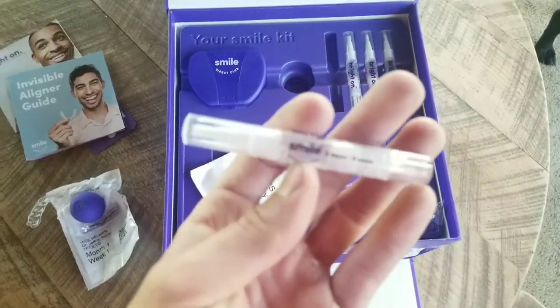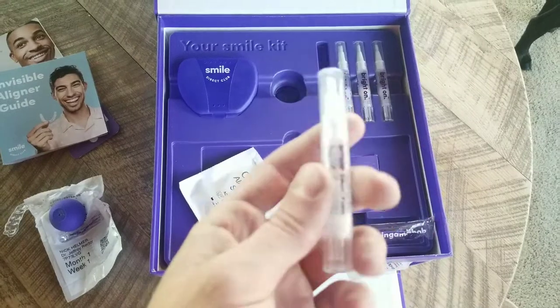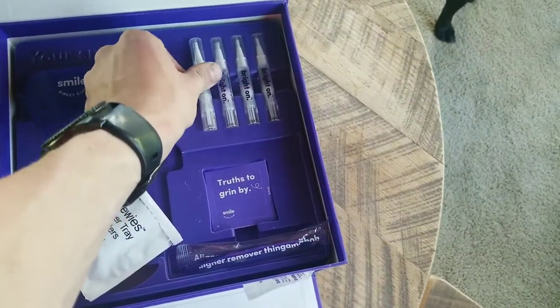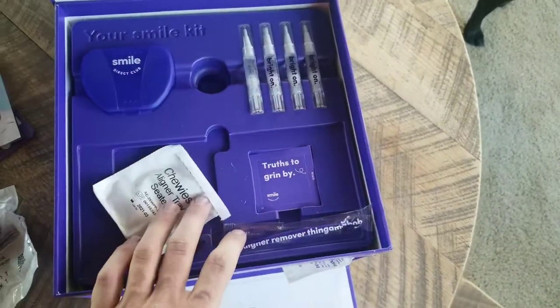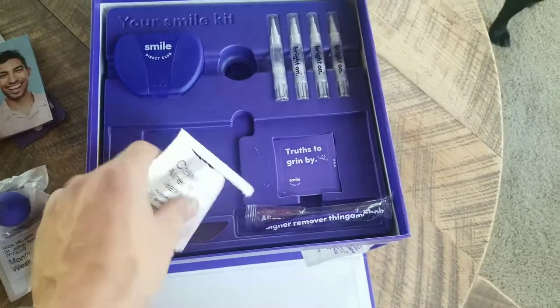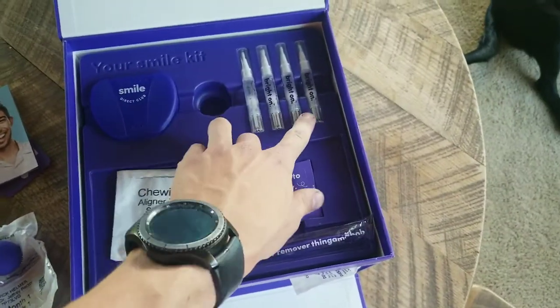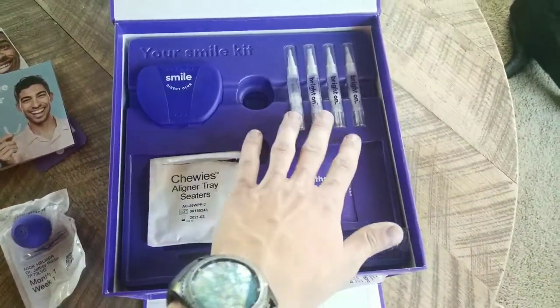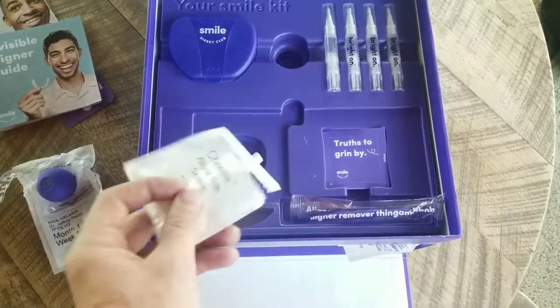The treatment is supposed to last — I think it's eight days, two days per pen, twice a day. It tells you to do it every six months, so that's a full teeth whitening essentially. You also get your chewies — I did open them so you could see, so I can do it with one hand.